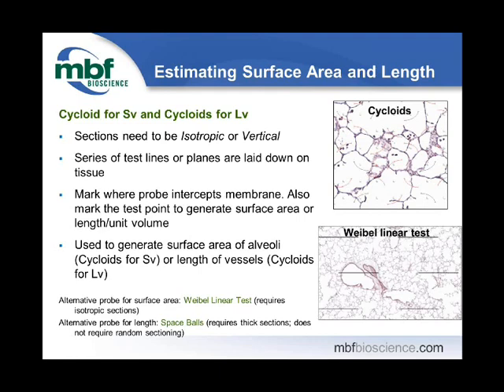So take-home message on this is we have various probes to use to probe for surface area. We use lines, and we implement other people's probes in our software. And to probe for length, we put planes down.